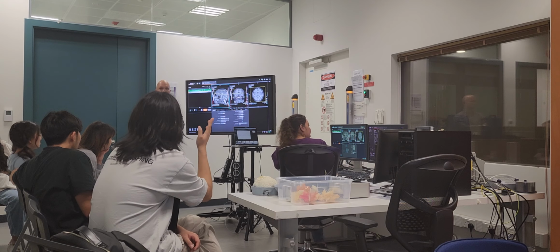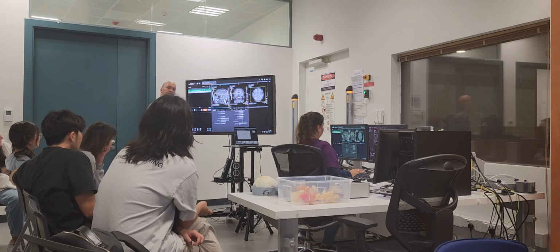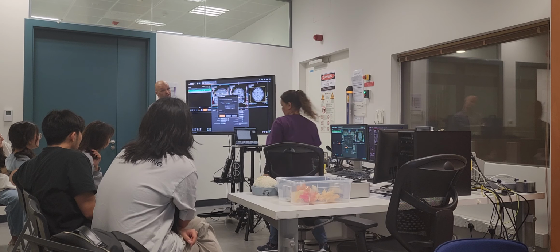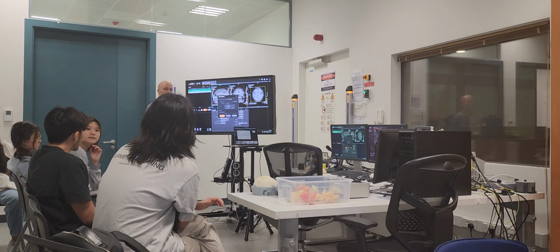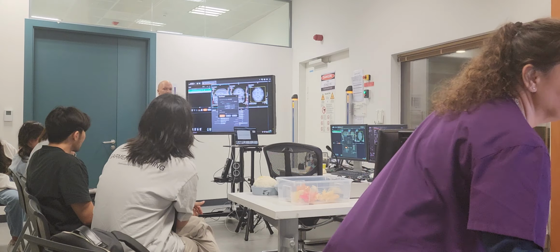I have a question. This MRI is just taking one scan per round, right? Per round? What do you mean by round? And remember, we have multiple types of scans. We talk anatomical, functional. What type of scans we talk about? Functional is with time scale, just static. I think anatomical. Anatomical, yes.